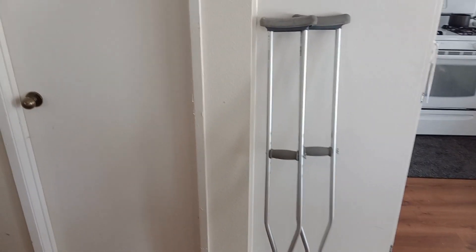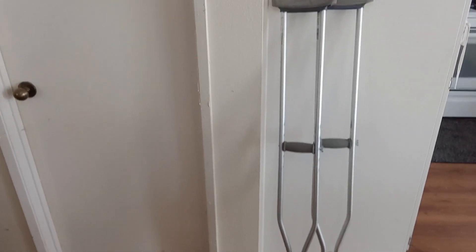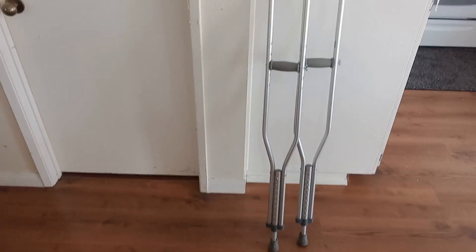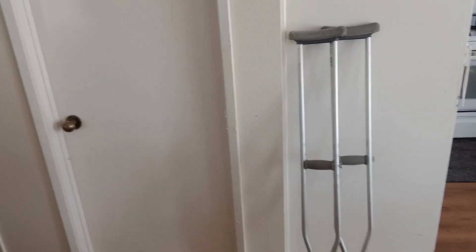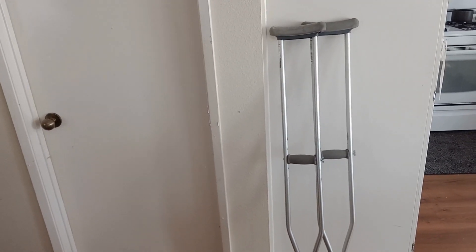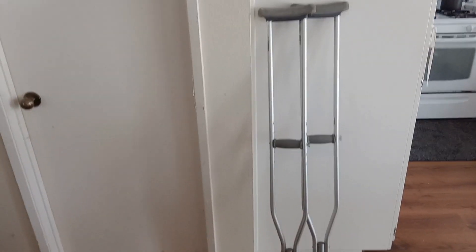Today I'm back with my crutches. These are also Drive crutches, just like the Drive walker. Drive is typically what makes crutches, walkers, wheelchairs — that type of thing — like medical equipment, I guess I could say.